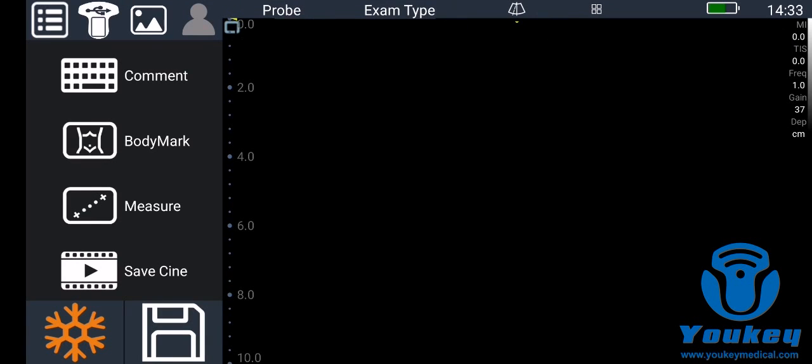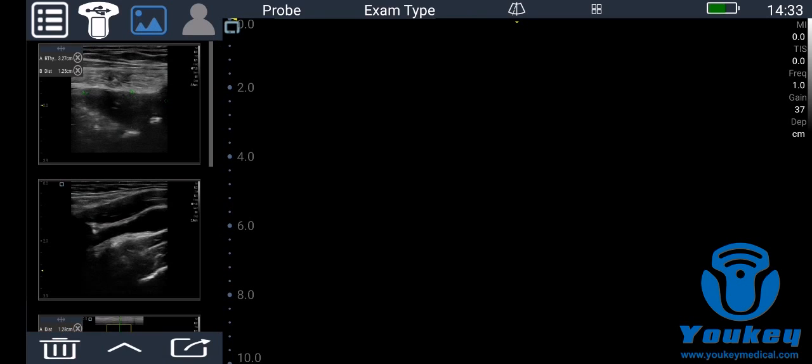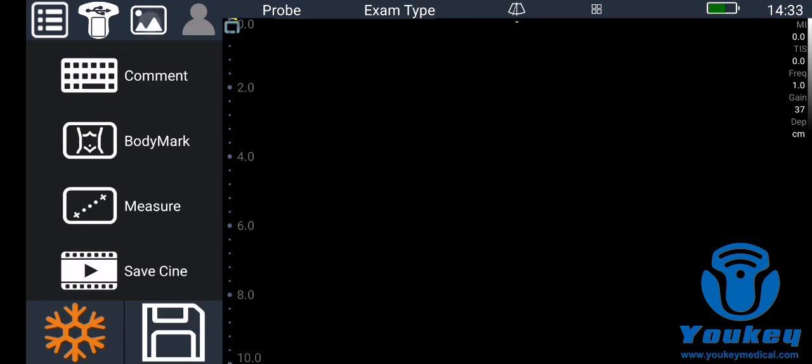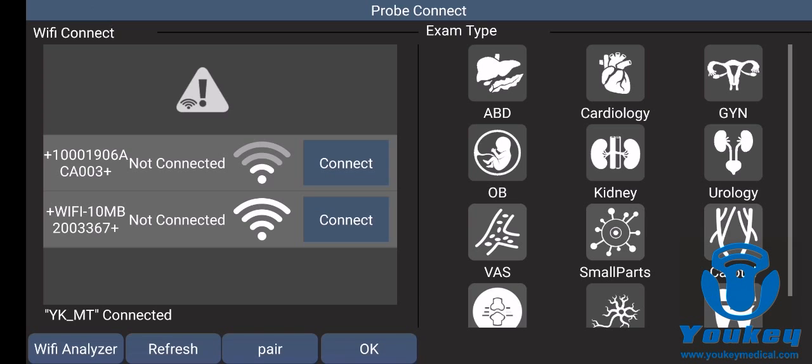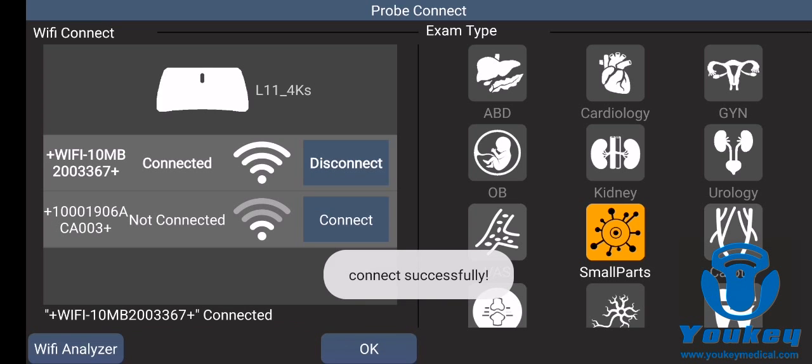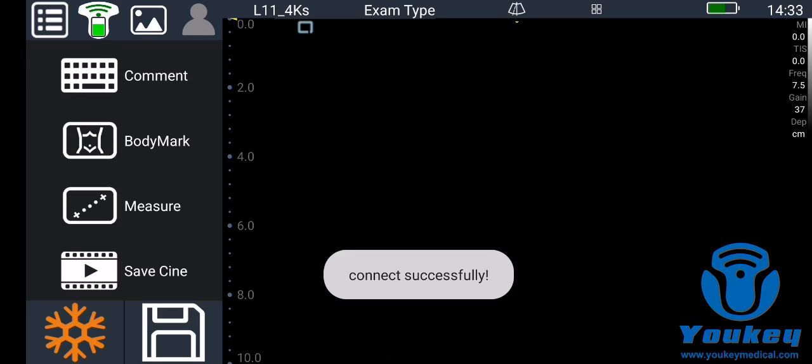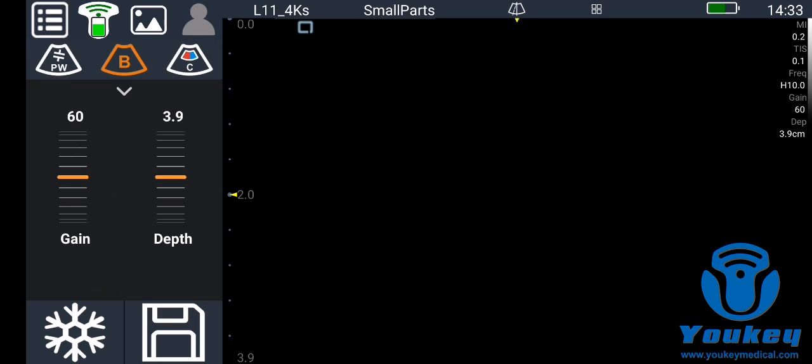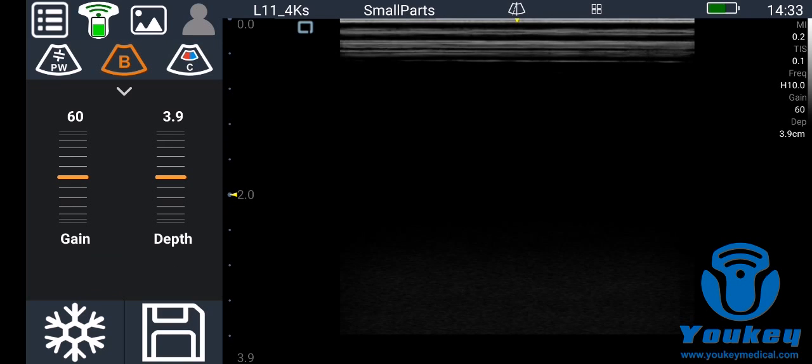Hello everyone, now I'll show you how to manage patient information on the UK wireless probe. First, when you don't connect the probe, the images are saved to an anonymous patient. After you connect the probe like this, click OK.